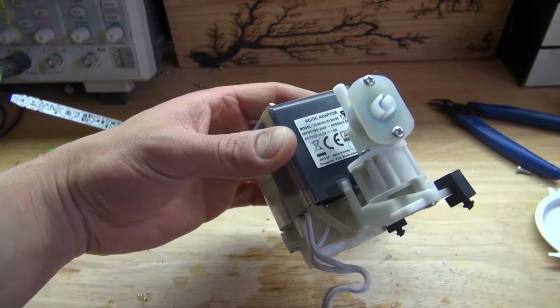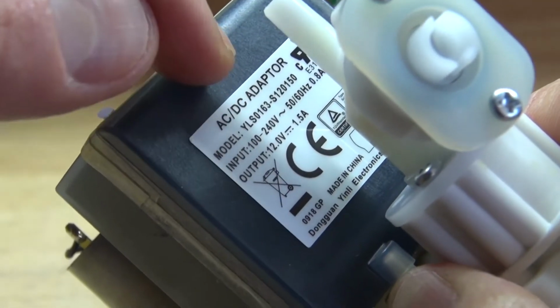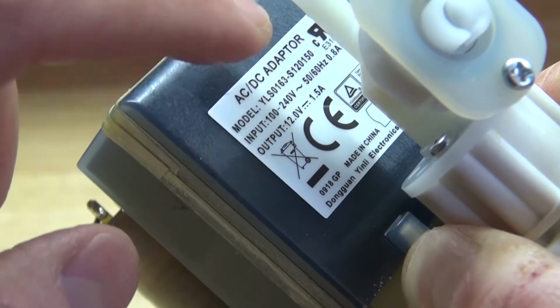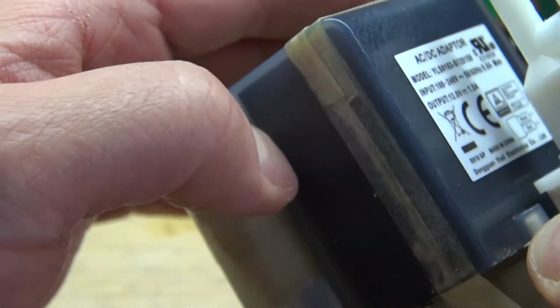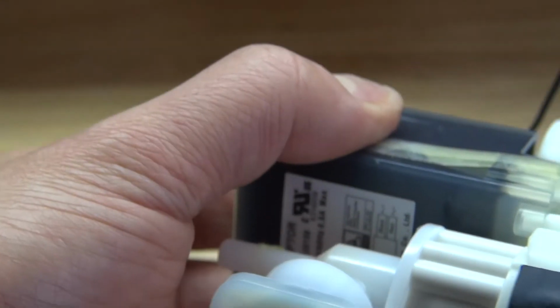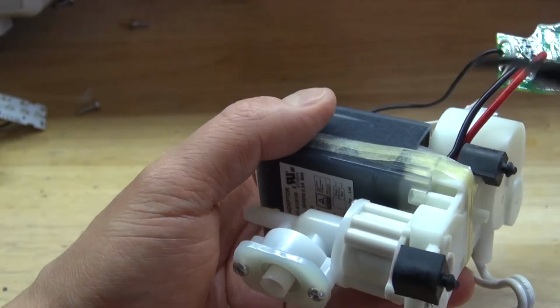Looks very interesting. And this right here is a 12-volt power supply, and you can see that it's perfectly insulated, perfectly watertight, which means this can be easily submerged into water and not short-circuit anything. That's actually very useful. I could possibly keep this on this device and use this as a water pump or a water fountain, or maybe use this to make some underwater LEDs. Possibly, I don't know. That could be very interesting and potentially very useful.